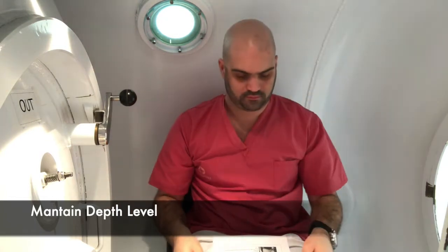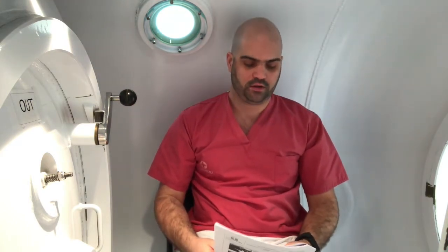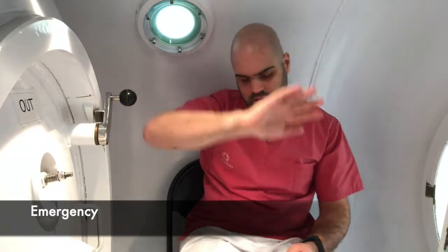If you want to maintain the same depth, then you have to do this sign, okay? With your hand flat, you just do a movement like this. This means stay at the same level or same depth. If you have an emergency and you need the special attention of the operator or the tender, you have to shake your hand very quickly like this, okay? This will mean stop. Stop any procedure, stop anything that you are doing and pay attention.